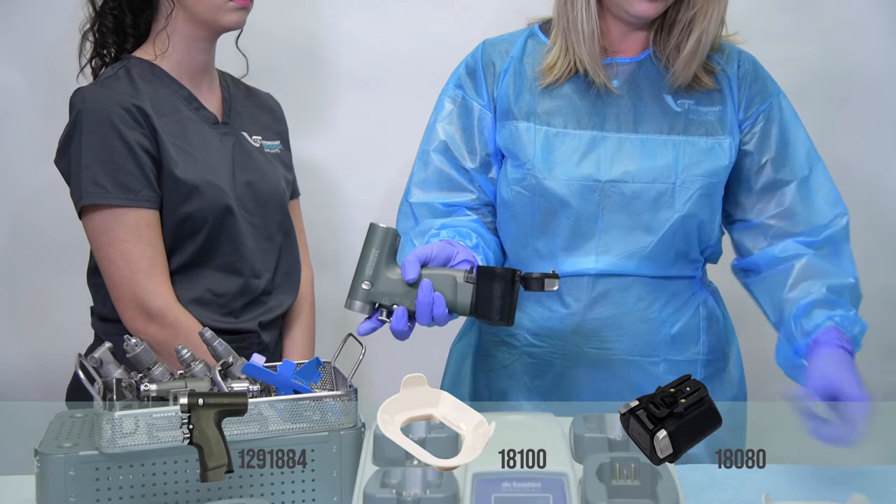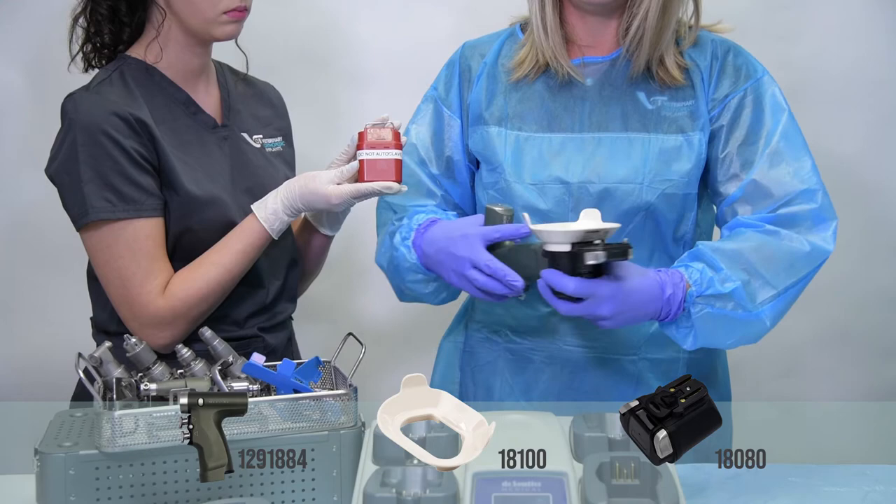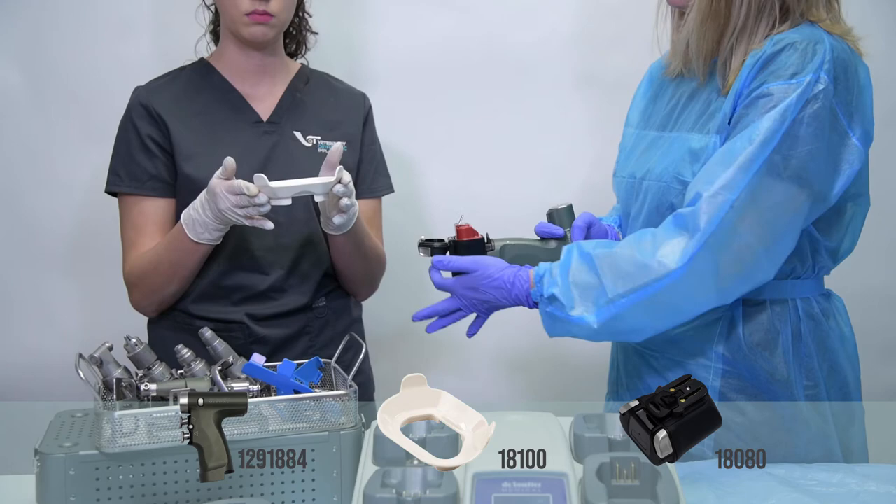You're going to then apply your sterile shield to the housing like so. As I'm the sterile individual in this, I would then bring my housing to my non-sterile personnel and they would drop the non-sterile battery into the housing. They would then remove the now non-sterile shield and I would close.